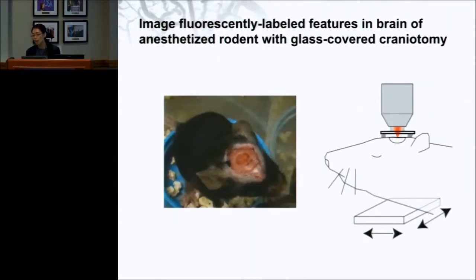And they have genes that have been associated with families that get early onset Alzheimer's disease. And although our multiphoton microscopy enables us to look deep, it doesn't quite let us go through a whole mouse. So what we actually do is implant cranial windows, basically a piece of glass right in the mouse's head, and then we can use this as a window to do microscopy.